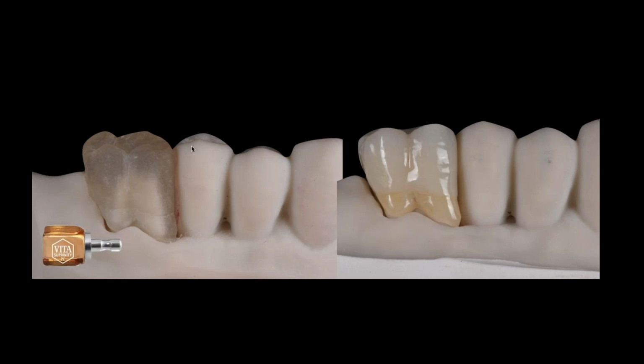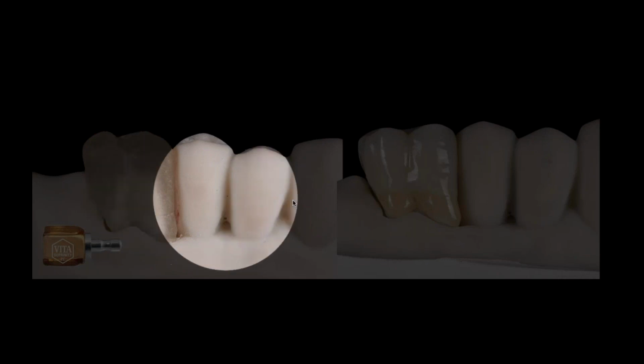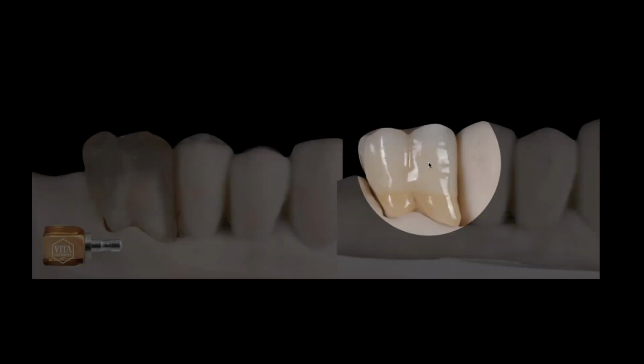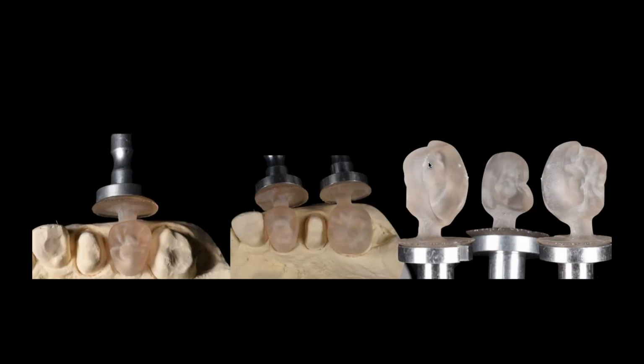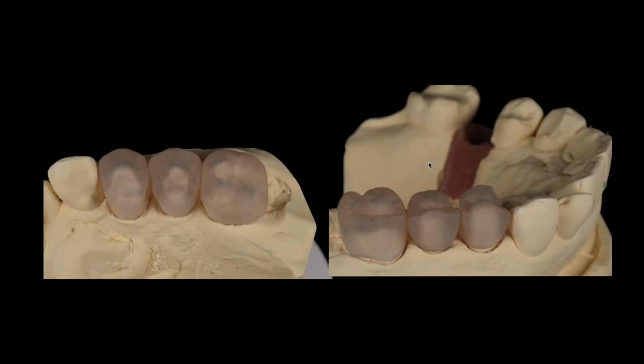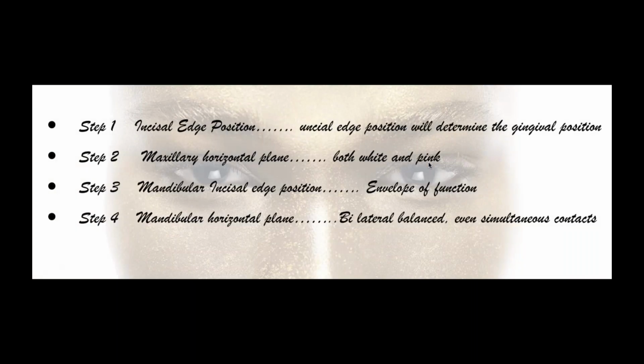And I also have the ability to grind, fit, and adjust the restoration because it feels like a resin at this point. And then we can paint our stains and just sinter it in a ceramic furnace, which I really love. Sintering is probably the wrong word. So we do lots of those in lots of situations where we can actually mill and make them both at the same time, and that becomes wonderful.